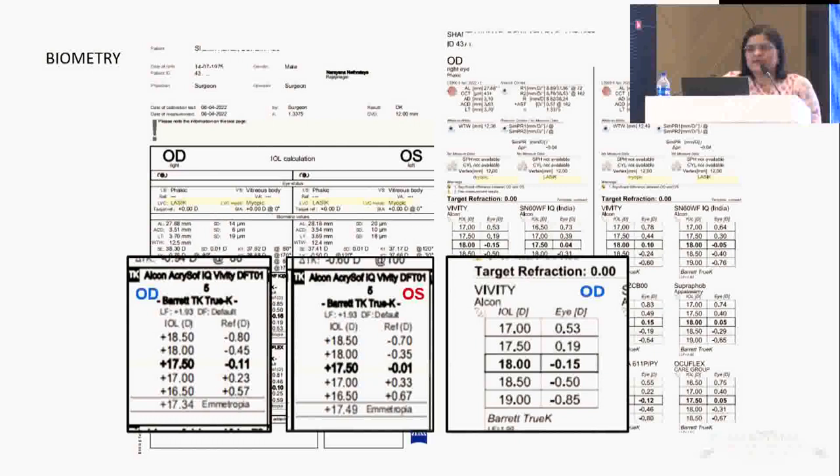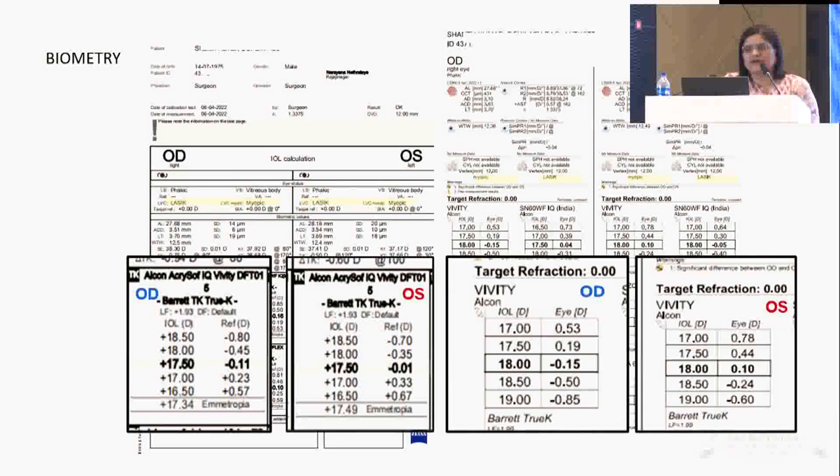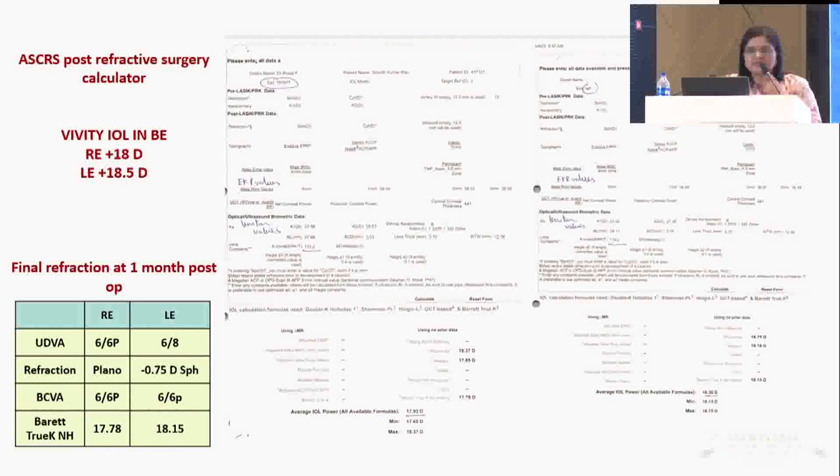Similarly, in the Lenstar, we got that in the right eye it was plus 18 and in the left eye it was close to 18.5. Now let's see what the surgeon did. The surgeon implanted right eye plus 18 and left eye 18.5.